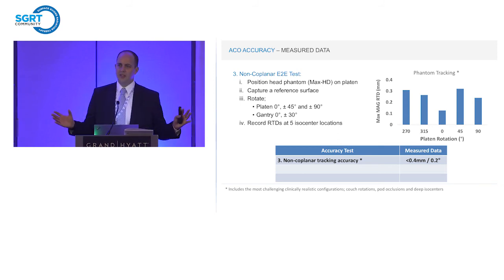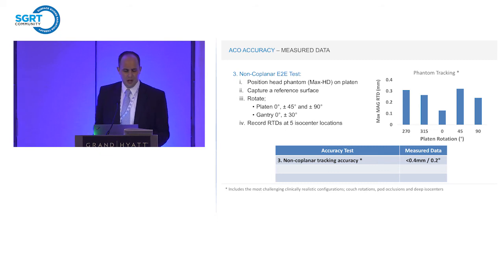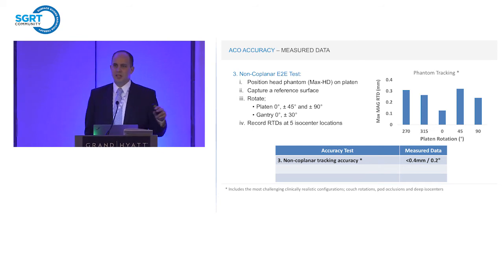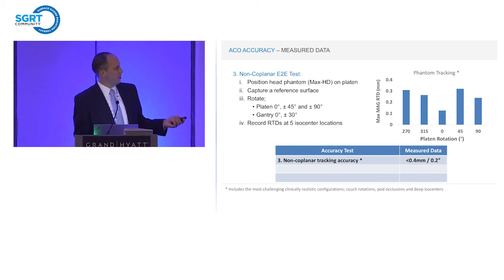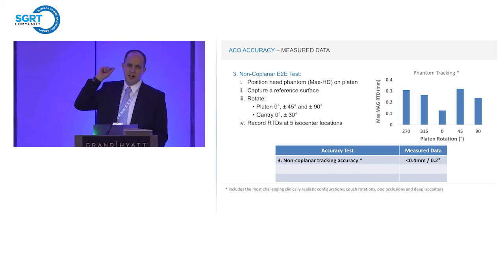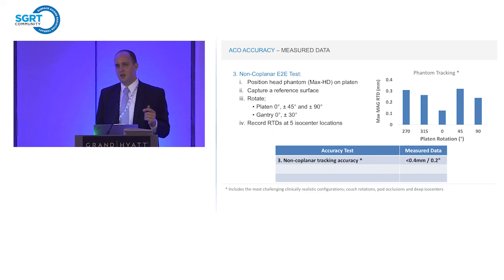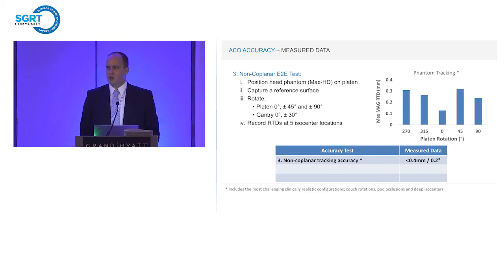Firstly, looking at all the data pulled together, I've split it out by rotation of the phantom here. But basically, the worst case we saw, so the largest real-time delta relative to the known position of the phantom using ACO, was less than 0.4 millimeters discrepancy. This includes the extremely deep offset isocenter, couch kick to 90 degrees, gantry blocking one of the pods. We still knew the position of the phantom to less than 0.4 millimeter accuracy and less than 0.2 degrees.